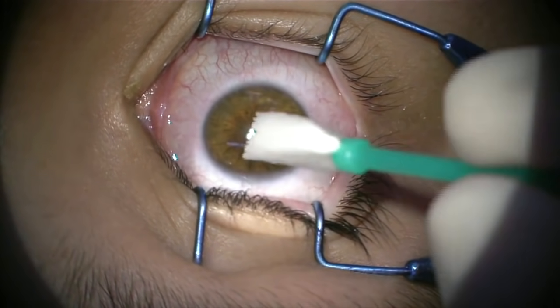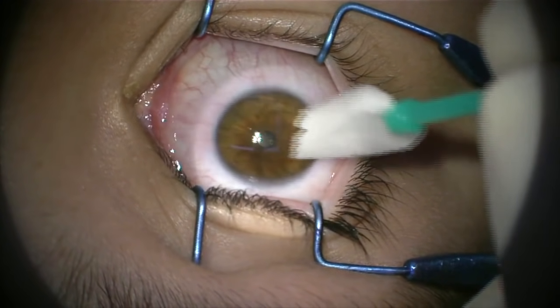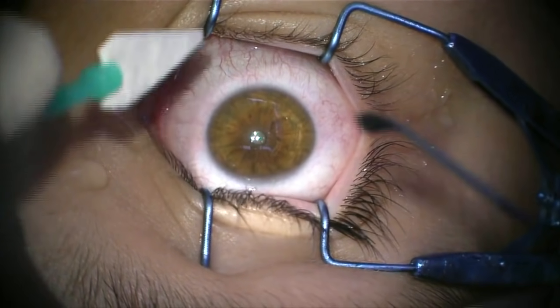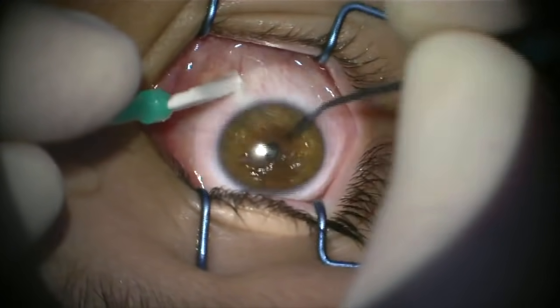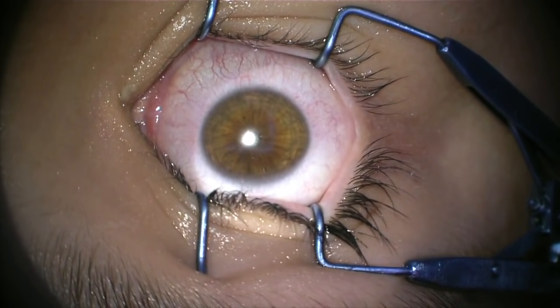Next, a special type of alcohol is delicately painted onto the surface of the cornea. This makes the removal of the epithelium much easier for both myself and the patient. Here you can see the epithelium being gently wiped off the surface of the cornea. The patient is aware that this is happening, but it really isn't uncomfortable at all — it's a strange sensation, but not unpleasant.